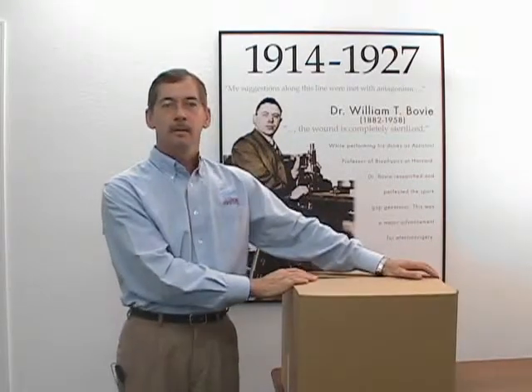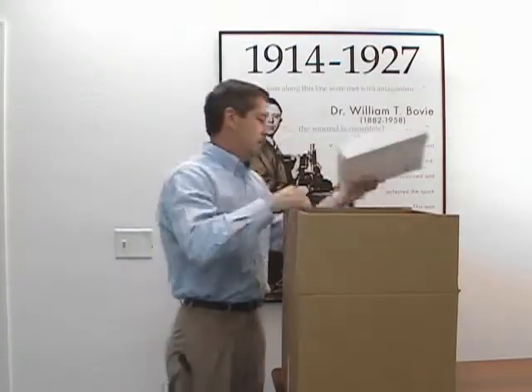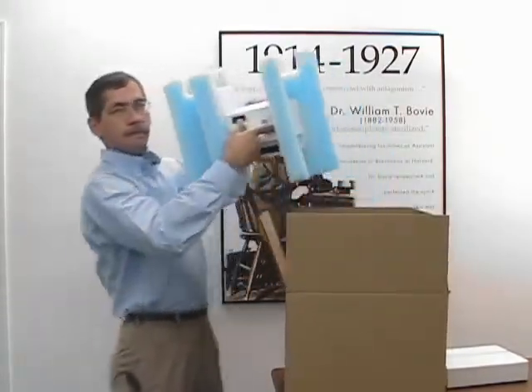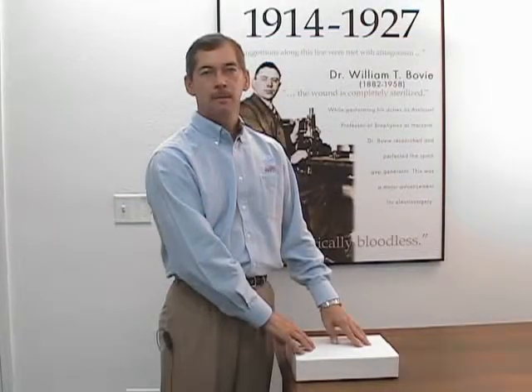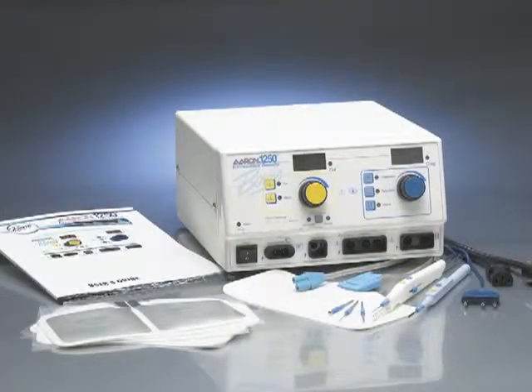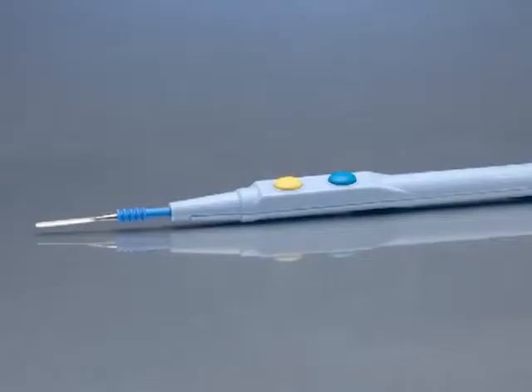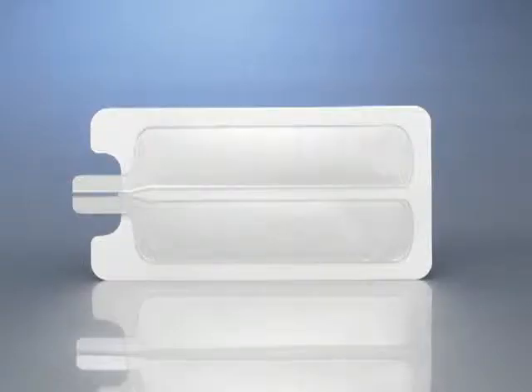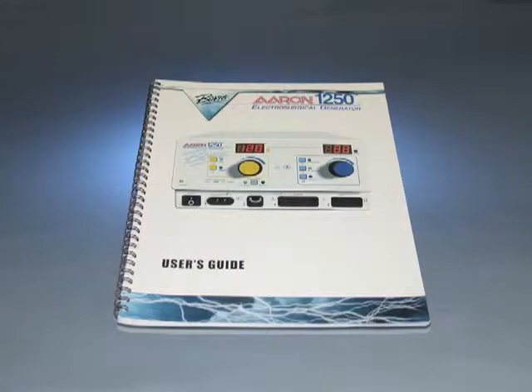When you open the box, you will find an accessory kit, and your ARIN 1250 packaged in protective foam. As you open your accessory kit, verify the following items are present and check each piece for damage: hospital grade power cord, one sterile disposable pencil, one reusable grounding cord, five sterile disposable split grounding pads, three sterile disposable electrodes, one blade, one needle, one ball, and a user's guide.